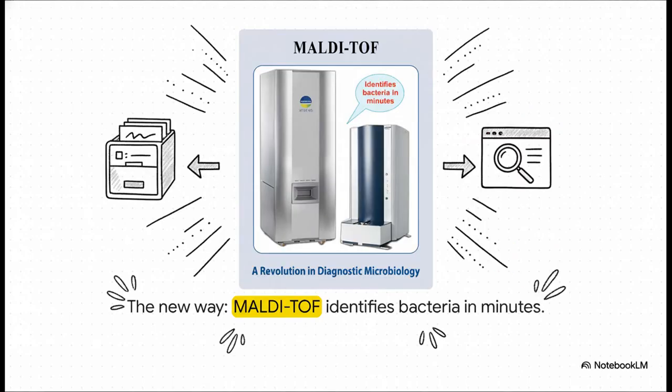But today, we have this monster. This is a MALDI-TOF mass spectrometer, and it is a total revolution. It has taken the identification time from days down to minutes. Seriously, it's like going from using a dusty old card catalog to using Google. And that speed makes a huge difference for patients, letting doctors get them on the right antibiotic much, much sooner.